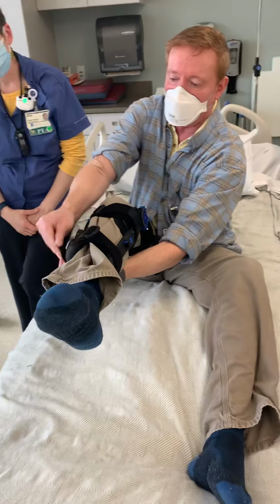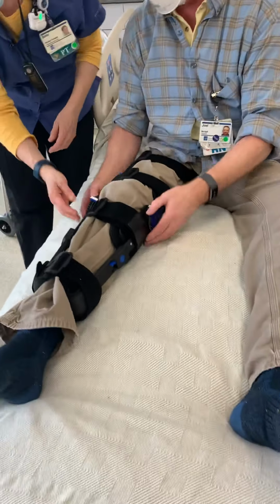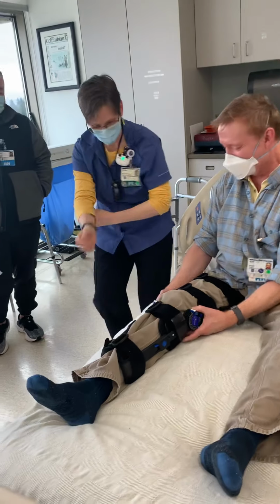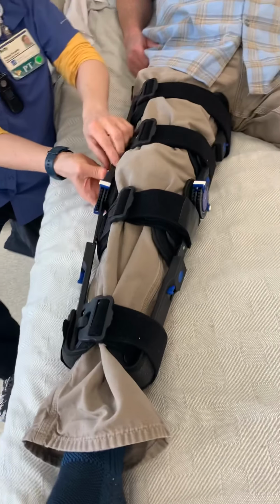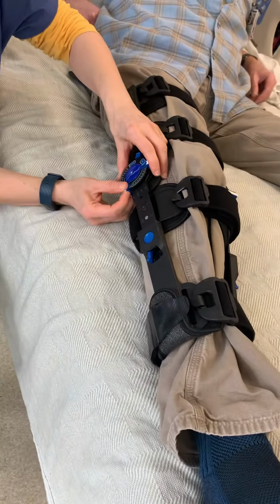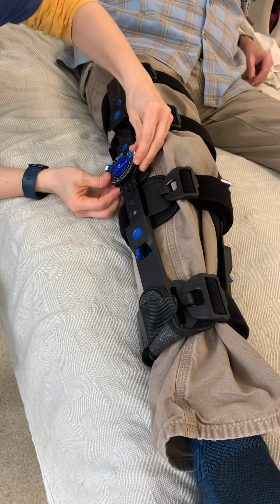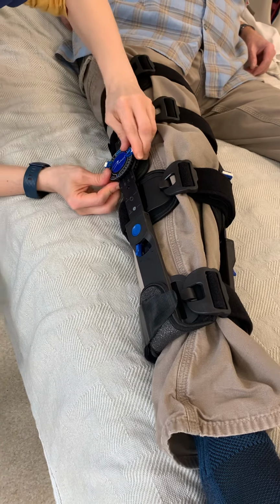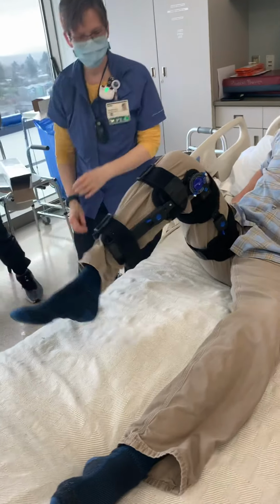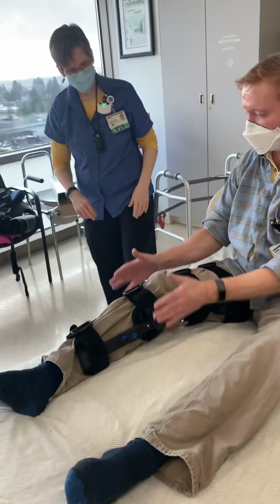Okay, and then I should be able to. Oh, this one's locked. You get one at 90. Isn't that a lovely instruction there, Joel? No, I'm serious. I walked in on braces like that. Or like, whoops, they forgot to do the other side. They're roughly in the right area. Okay, now go ahead and try. Nice. There you go. 0 to 90, and it's supporting me for no lateral movement. So that's some patients we have that.